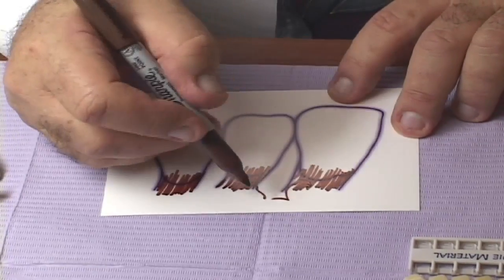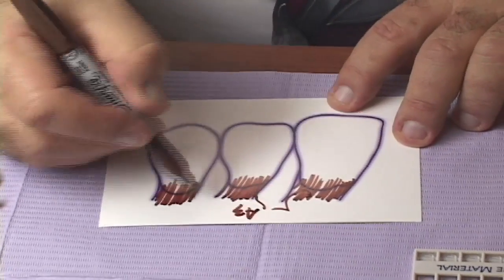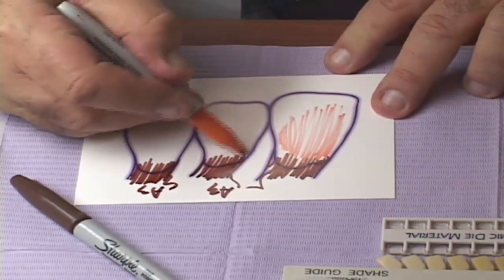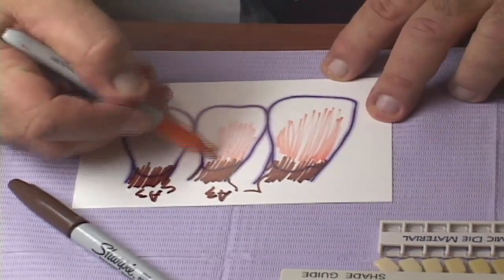We have central, lateral, and cuspid, and we mark the area that is describing as the dentin or the root color. I always use the same color pens to identify a specific location on the tooth. I use brown as the neck or the root color. We use orange to represent the dentin area — what part of the tooth is the dentin covering. The part of the tooth covered by orange is being described that way.